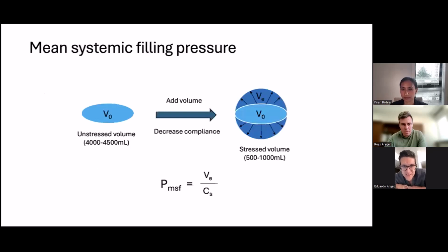That's a fantastic slide. And then of course, what do you do with a low VTI in sepsis? Is that really a goal? Should I normalize it, or should I go all the way and do like my friend Glenn Hernandez in Chile, care a little bit less about the VTI and more about my capillary refill time, and then increase my vasopressor, and maybe that takes care of the problem.